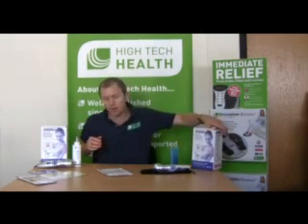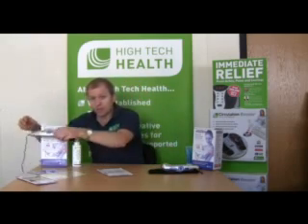Let's look a little closer at how it works. This is therapeutic ultrasound — don't confuse it with diagnostic ultrasound. Therapeutic ultrasound has been used for a long time by physiotherapists for soft tissue recovery.